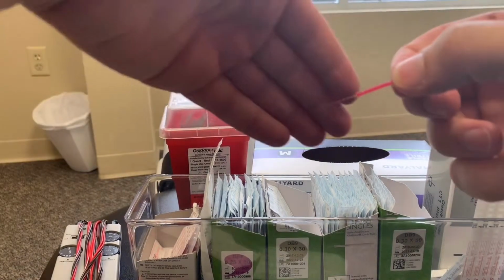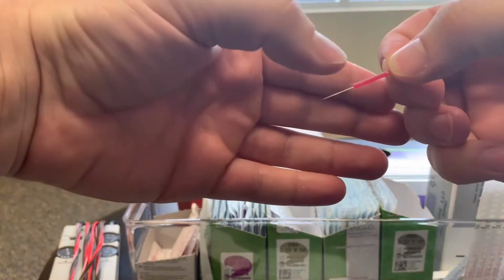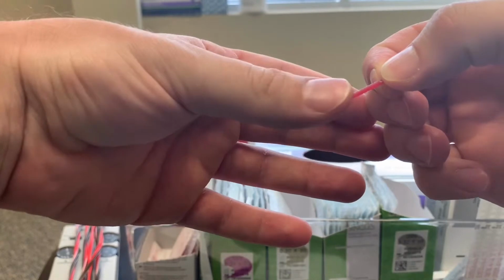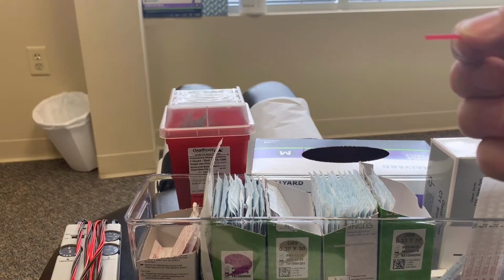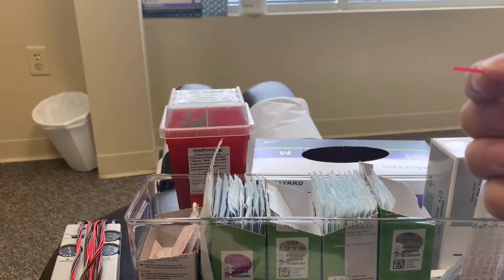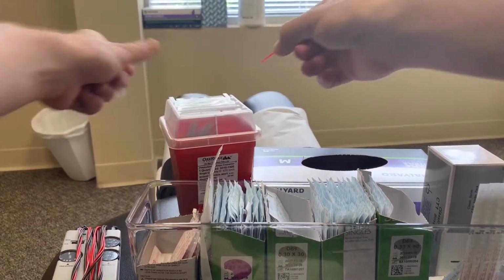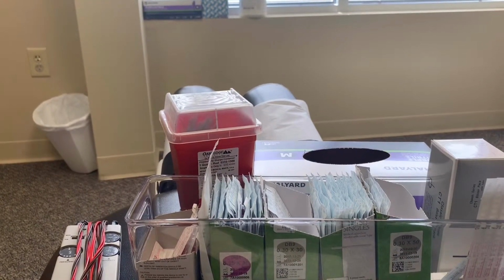And you can see if I put my hand behind it there, that it's a really short needle and it's really a thin needle. I can kind of tap on it and you can see it actually just bent there. Needles typically don't really bend that much with dry needling. I've never had a needle break with dry needling. I guess it theoretically could happen, but it's probably pretty rare. These things are really high quality.